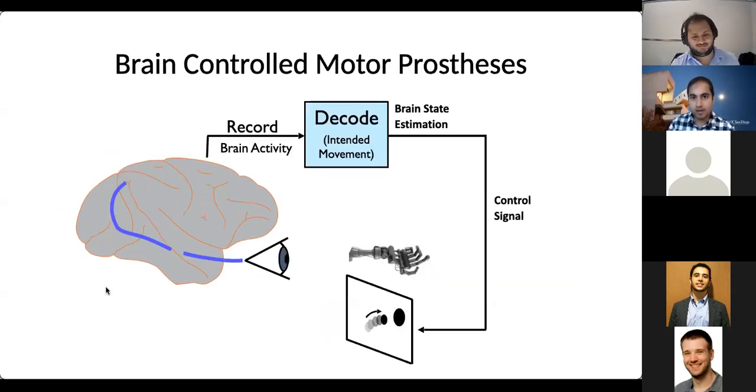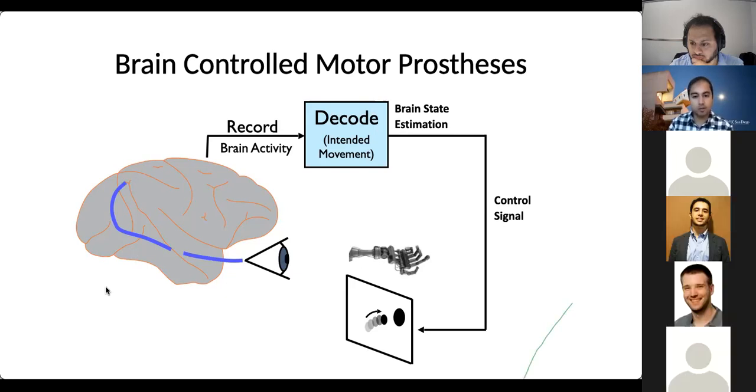In particular, I think about and focus on brain-controlled prostheses. These are systems that primarily focus on measurement from the brain, although you can stimulate to write feedback back in. But the systems that I'm primarily working with use the sensory system to feed back into the brain.